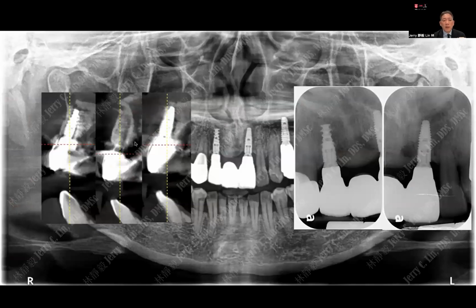So you can appreciate that we have a very good pontic area, and we have the implant placed in a correct position, and we have a good emergence profile and good running room for the aesthetics. Basically, follow the protocol, follow the emergence profile, how we build it up.